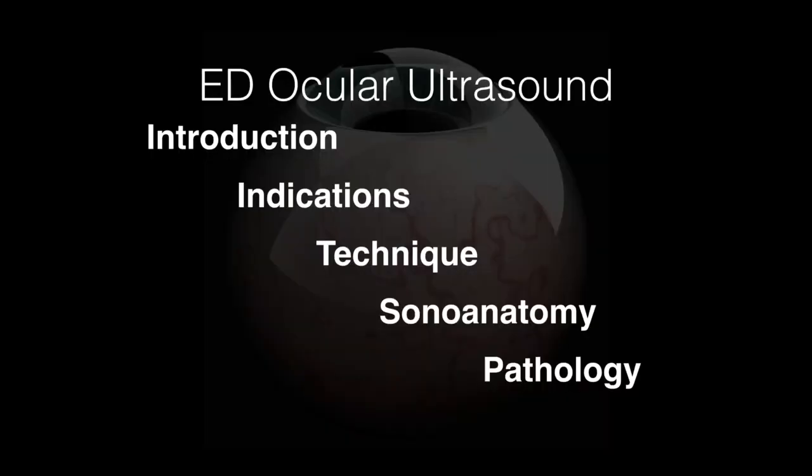So, today we're going to go over a short introduction into ER Ocular Ultrasound. We're going to go over indications, the basic technique, sonoanatomy, and pathology.